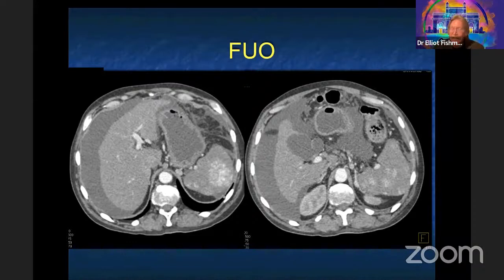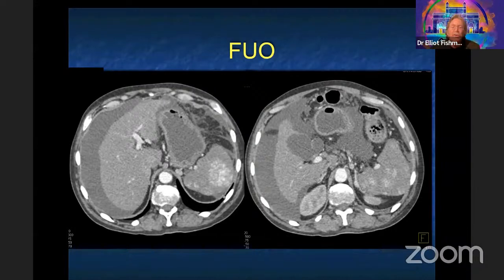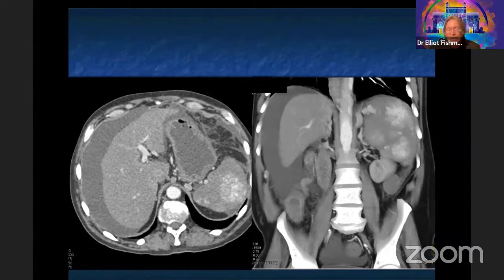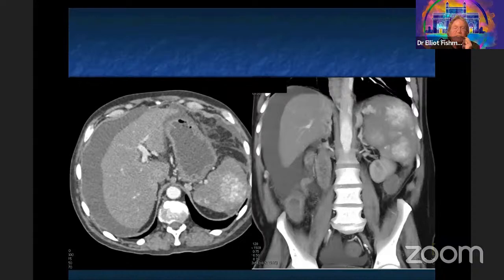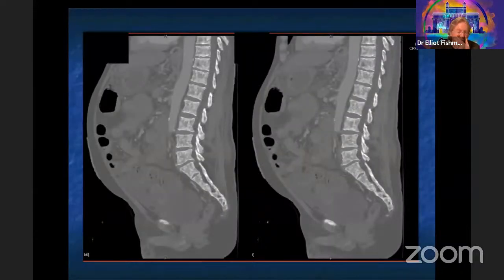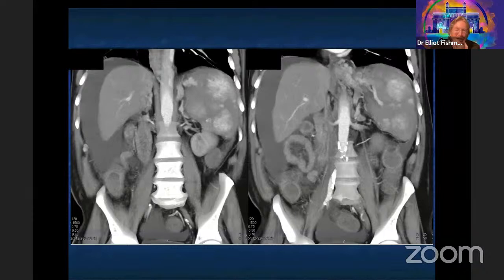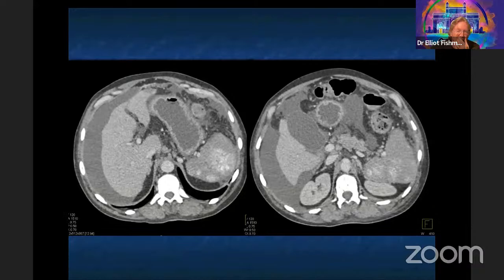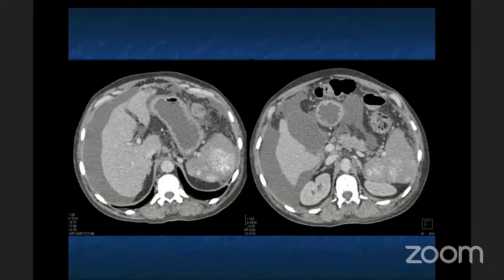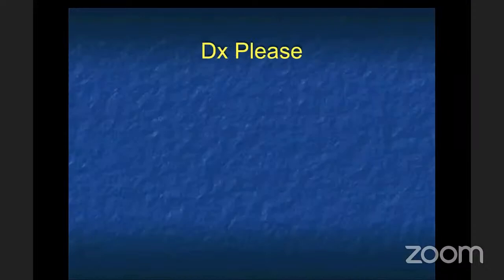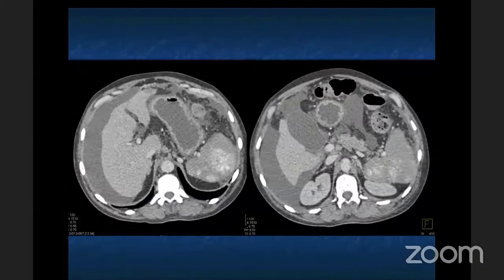These are routine cases Linda and I see every day. Patient presents — 50-ish year old male with FUO. I'll show you a couple images. Look at the spleen — what's going on there? There were no calcifications in the spleen on the non-contrast scan. Here's some 3D showing of the spleen and the extensive ascites, and here's the venous phase. Answers coming in: angiosarcoma, splenic hemangioma, hypervascular mets, angiosarcoma, lymphoma, hematoma.